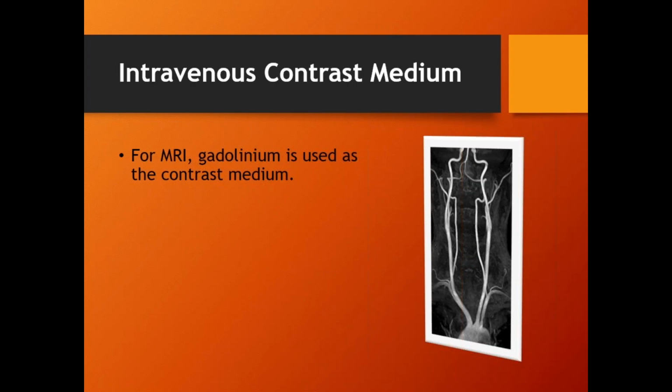So the reason we put the patient into this magnetic field, a typical MRI is 3T, 3 Tesla, which is 30,000, am I doing my math right? 30,000 times the Earth's magnetic field. The magnetic field that makes a compass do its thing, that is 1 Gauss. And I think, if I recall, 1 Tesla is 10,000 Gauss. So an incredibly powerful magnet.